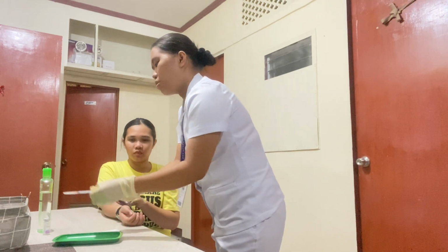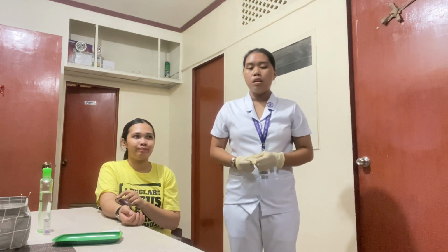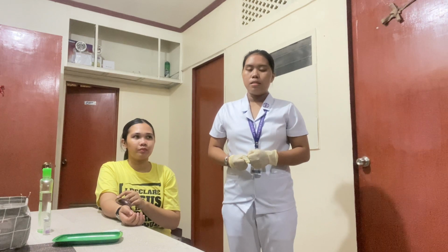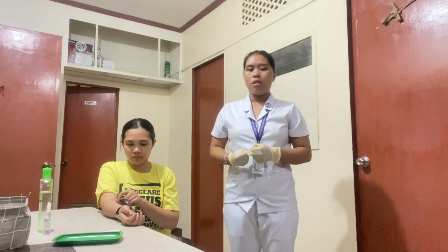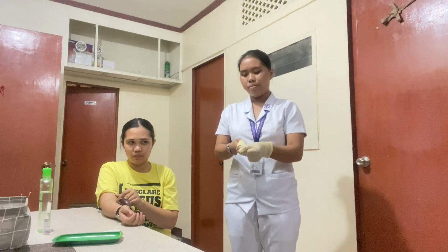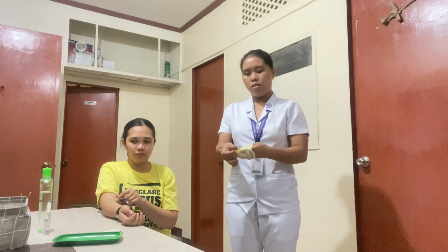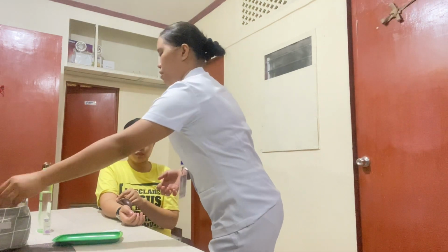Then dispose of it into the bin. Now, do not massage the area. This is to avoid dispersing the medication into the tissue. And also remove the gloves. And after that, perform hand hygiene to deter the spread of microorganisms.